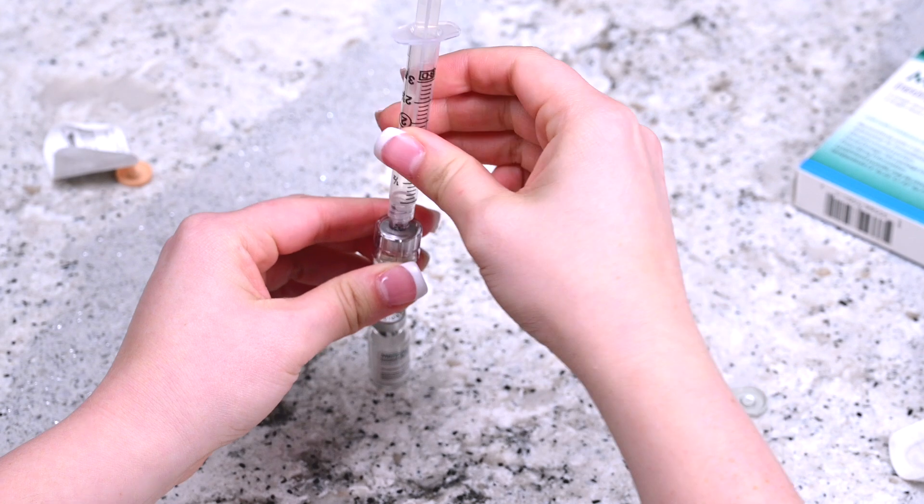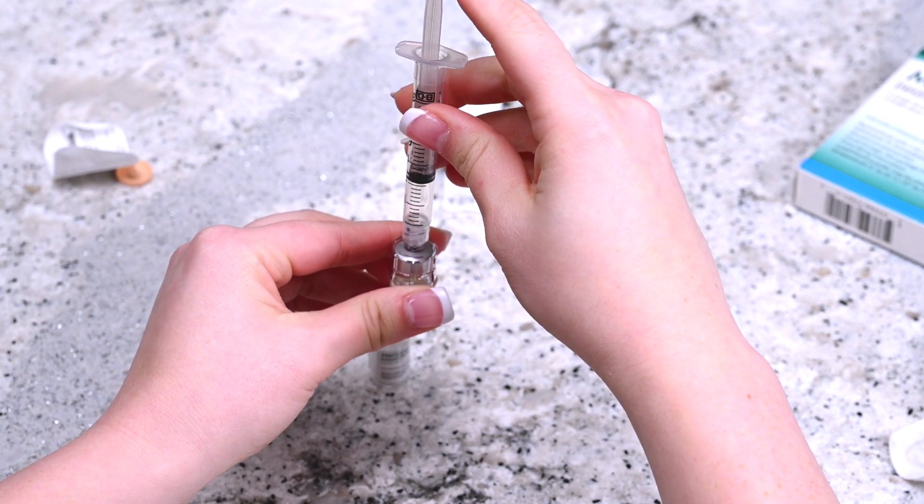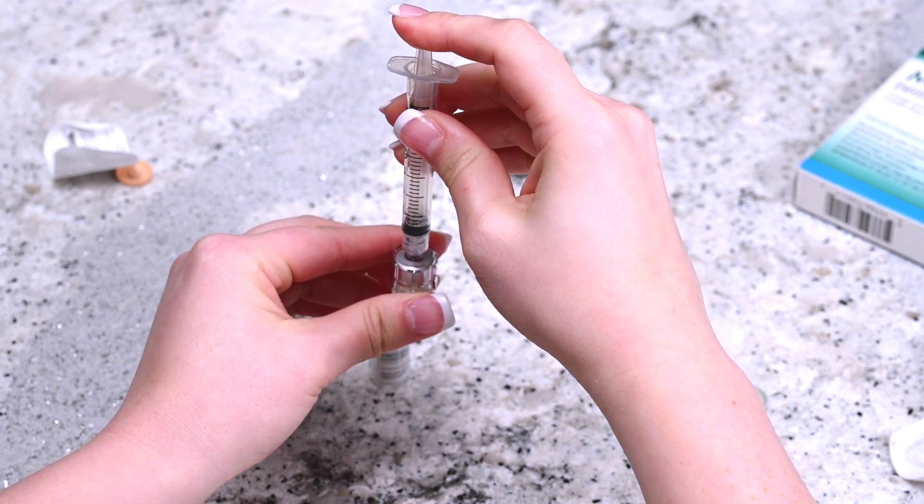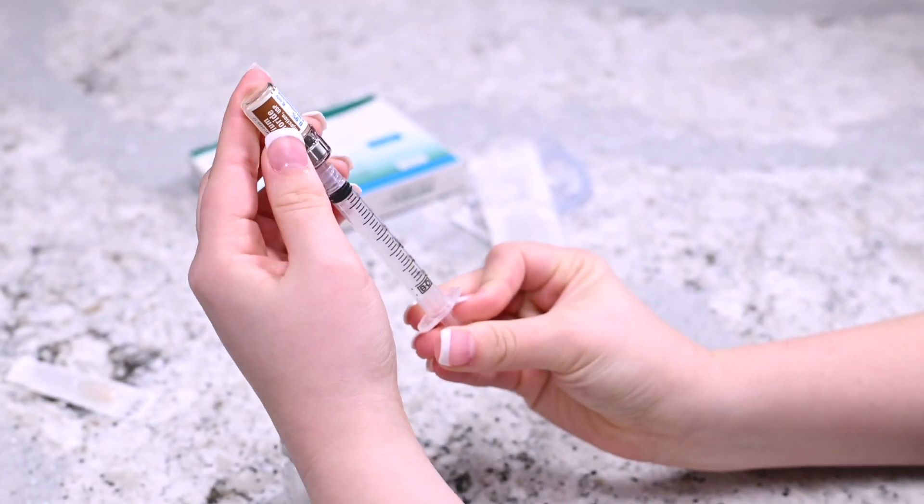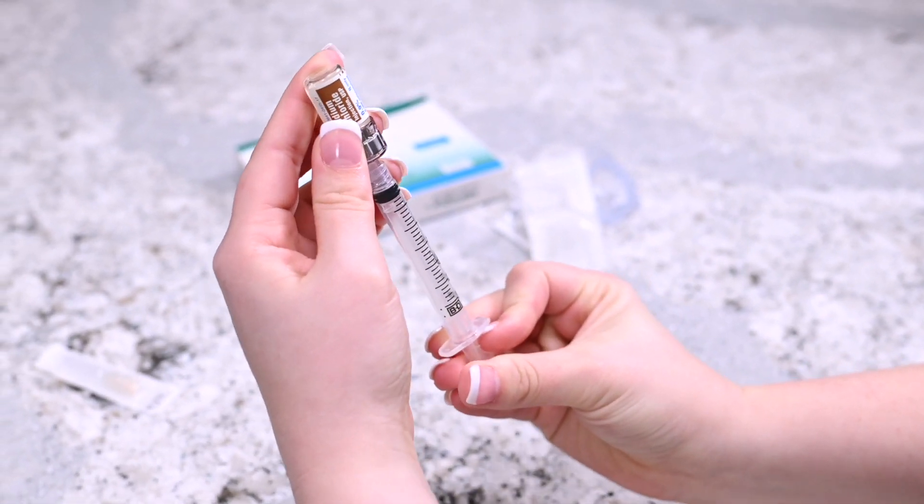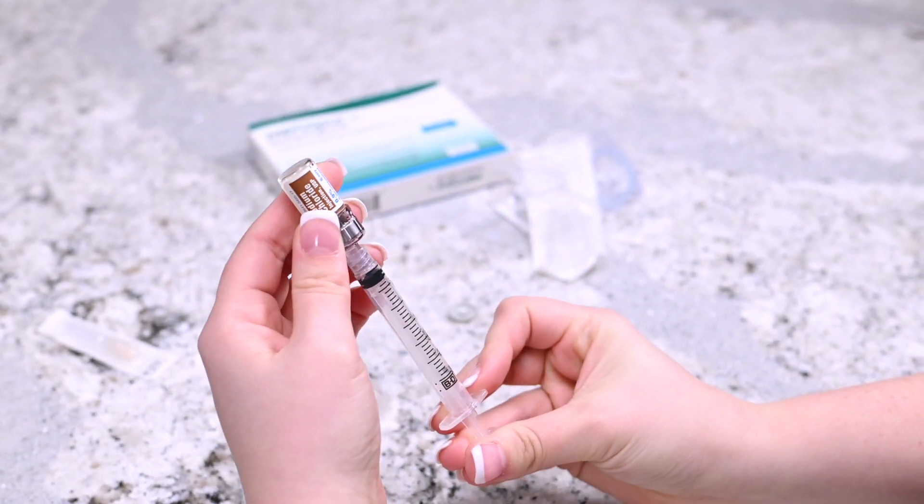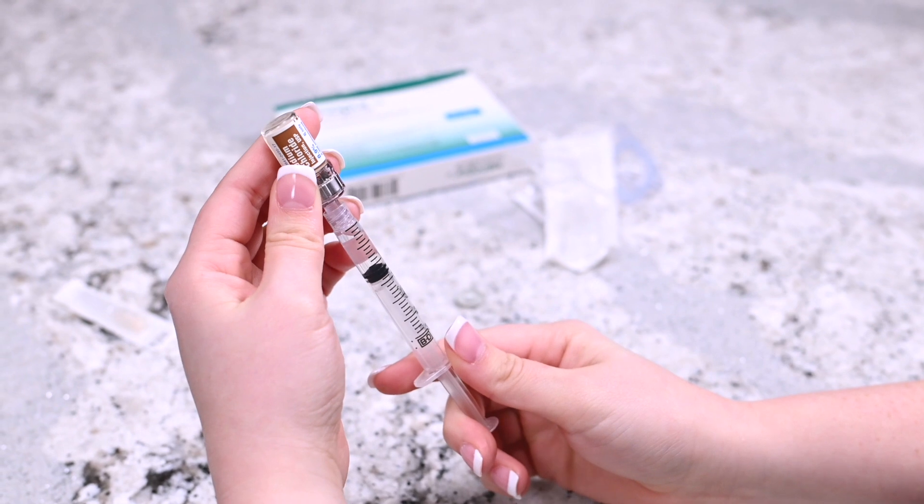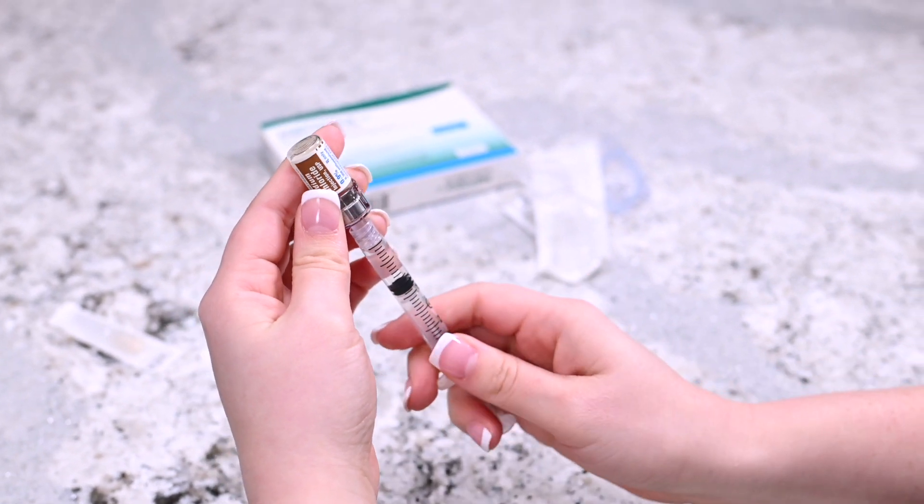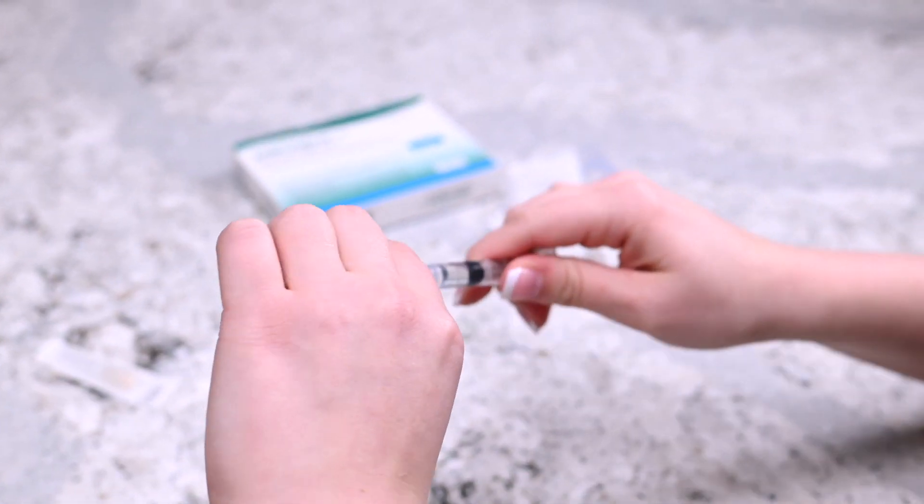Gently apply pressure onto the plunger so that the air transfers from the syringe into the diluent vial. Invert the syringe so that the vial is upside down but still attached to the syringe. Pull the plunger back slightly past the one ml mark. Remove the syringe with the attached q-cap from the vial and set the vial aside.